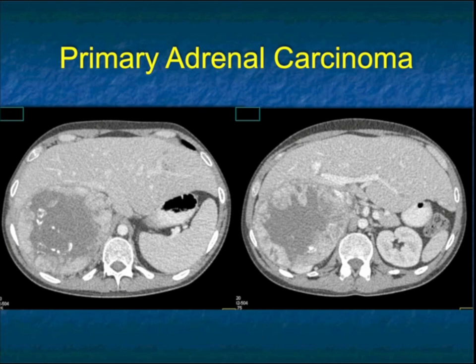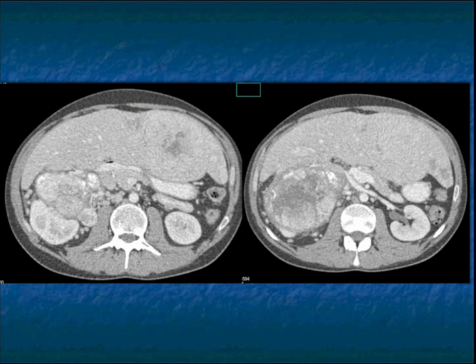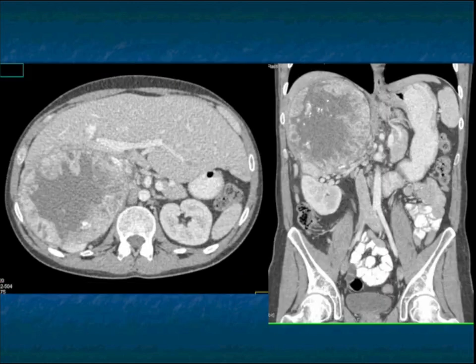Another example, very similar, right? Central necrosis, calcification. Here the patient has a lot more nodes and collateral vessels because there's vascular invasion. The nodes are often very vascular, as in this case. Again, you see the pushing of the tumor. Sometimes on right-sided tumor, it's hard to tell IVC involvement because the IVC is compressed rather than invaded and there's so much tumor present. So it can be a bit tricky.